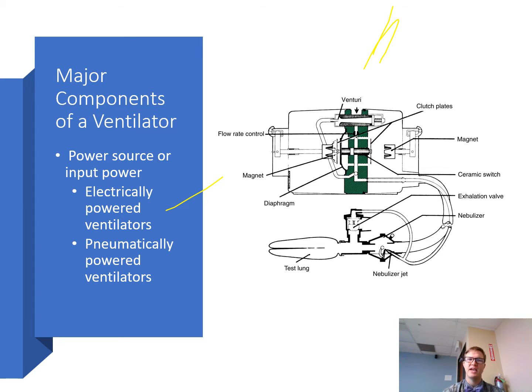So they were great to aerosolize medications to people that were spontaneously breathing that had reduced ventilatory function, like patients that had spinal cord injury or neuromuscular issues or chronic obstructive pulmonary disease patients that didn't have a strong inspiratory flow rate. Well, this machine delivers that medication with a positive pressure to help with distribution of that medication into their lungs, especially if they have a hard time getting that breath into their lungs, like with a neuromuscular disorder, spinal cord injury, anything that causes muscle weakness.